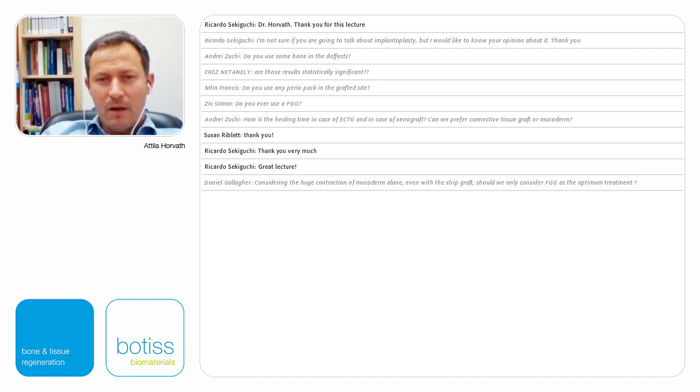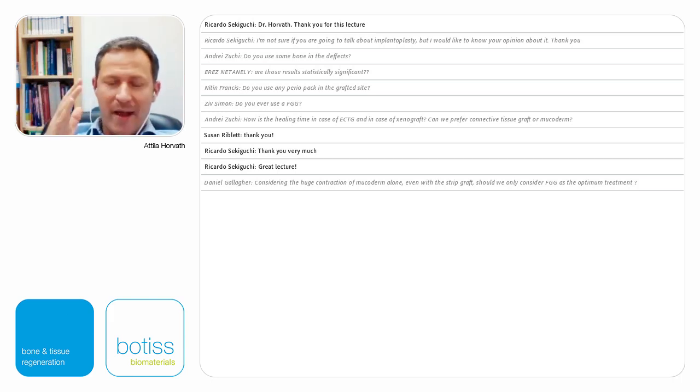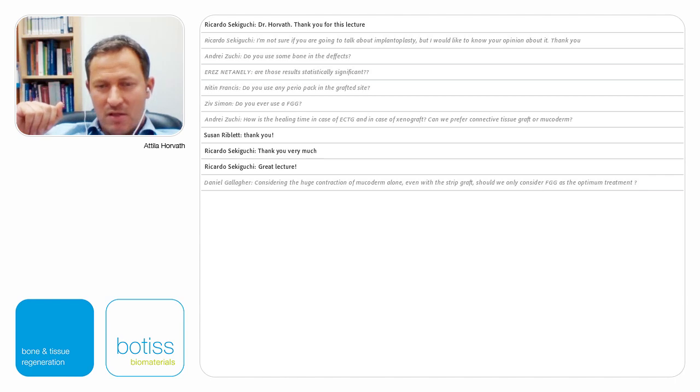Well, Danielle, you might remember the huge contraction that occurred with allograft. I wouldn't say there's a huge contraction with mucoderm. It's very good that you asked the question. Maybe I was not very clear. So in terms of contraction, the best is the gold standard, which is ECTG, or say FGG if you would like. Then mucoderm is predictable. If you would like to stay on the safe side, use it in combination with a strip graft, so with an ECTG, because that is very predictable. And if you use mucoderm only, I could say that in the upper jawbone it is absolutely predictable. So I don't think contraction is a matter.